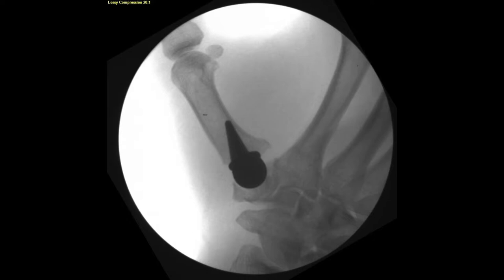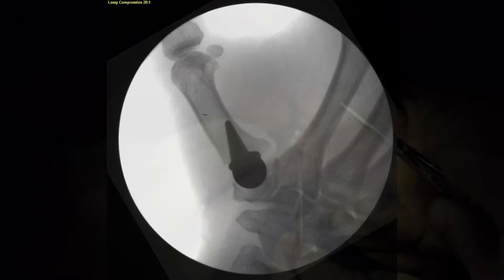Fluoroscopy is brought in and shows good position of the implant with adequate fill of the trapezium, and the stem typically will abut the medial cortex of the metacarpal.